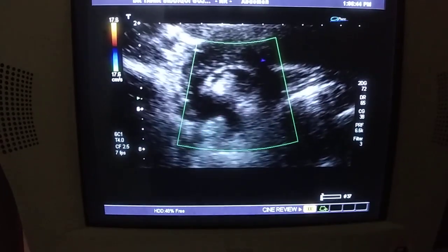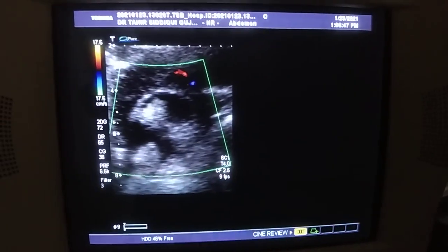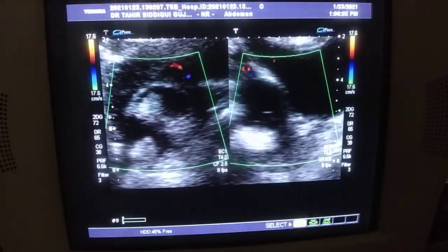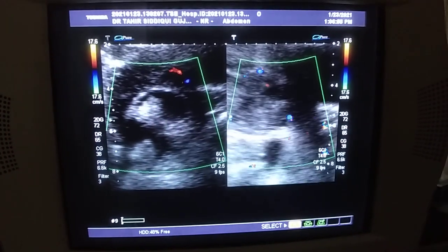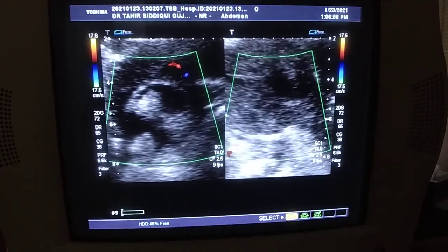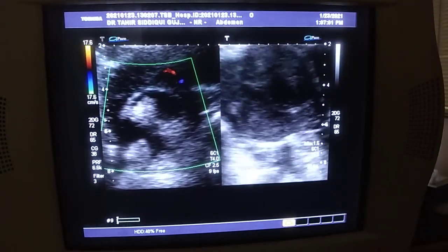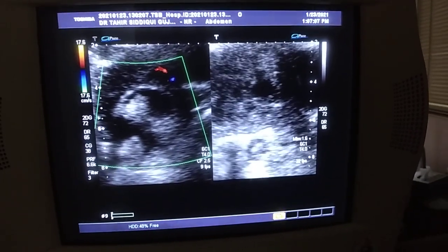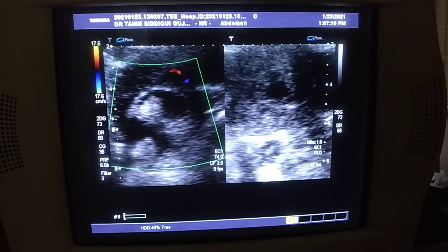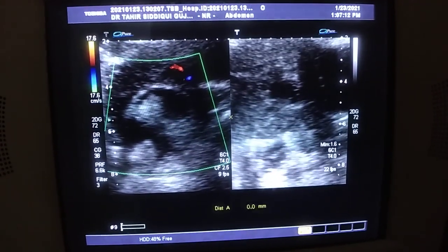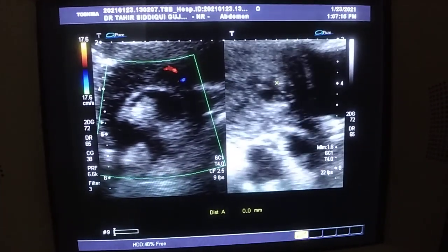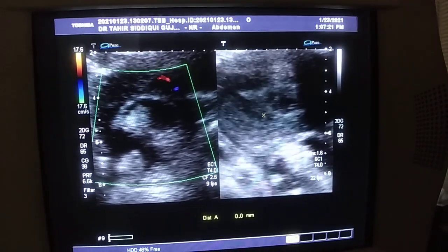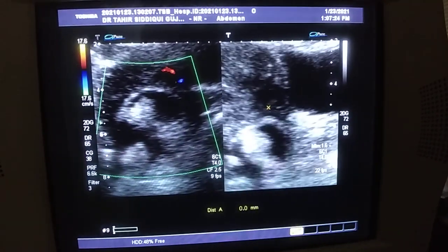Now this is a magnified view of the uterus. The uterus is slightly bulky with the endometrial canal dilated up to 18 millimeters. The endometrial canal in the lower segment is dilated with echogenic areas, which represent bleed. This is the cyst adjacent to it.